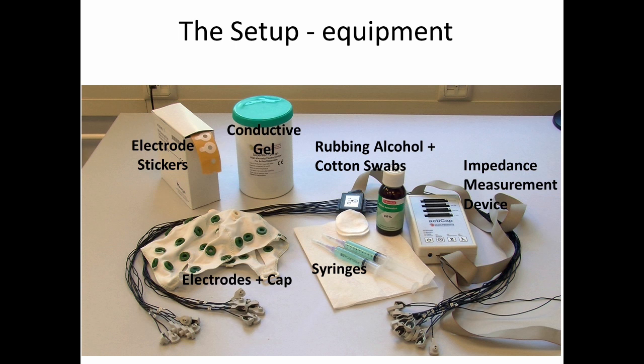Electrode stickers are used in some cases to put on, for instance, an electrode below the eye. In order to put that on and get a good signal we use rubbing alcohol and cotton swabs to clean the skin. In order to make sure that we have good signal with the scalp, we'll measure the impedance of the electrodes to make sure that they are sending the proper signal.